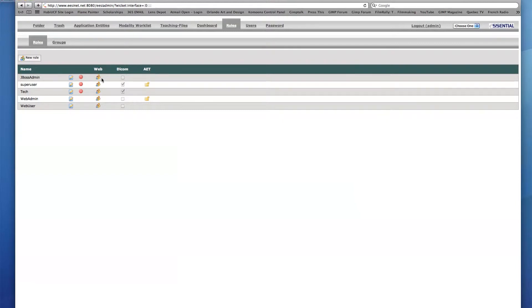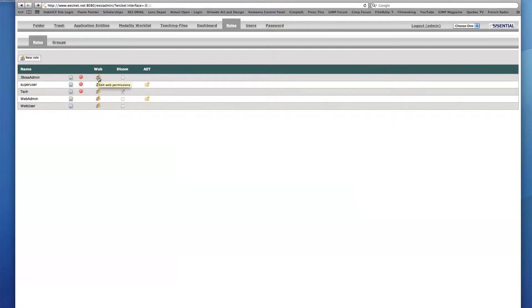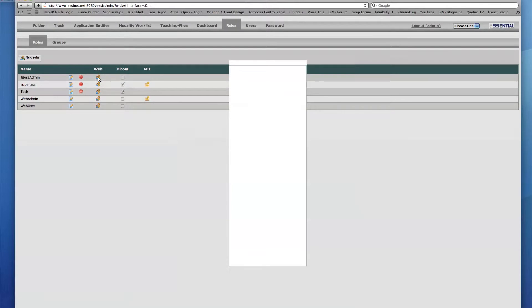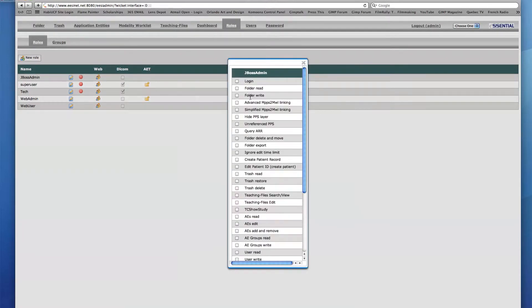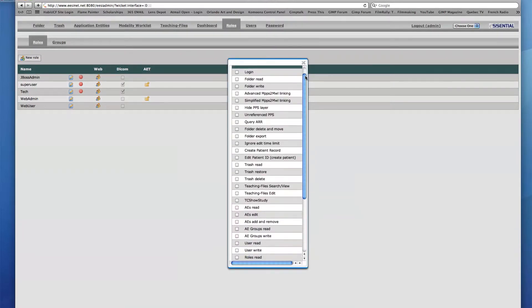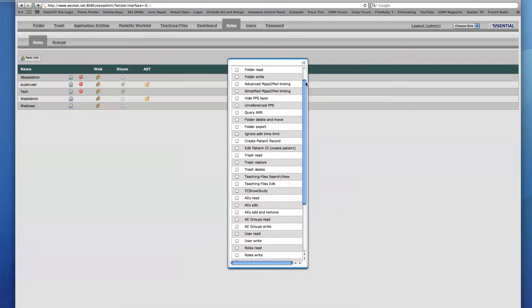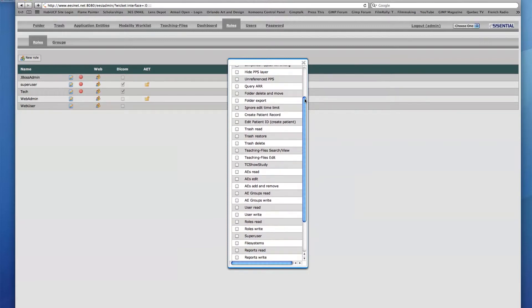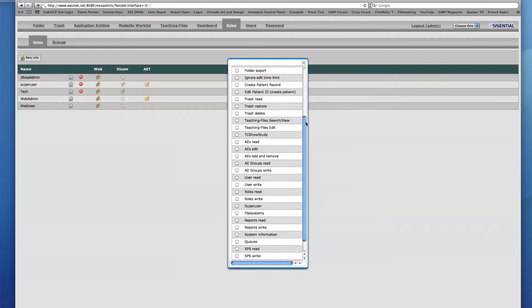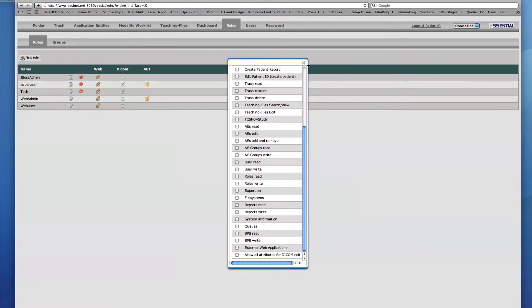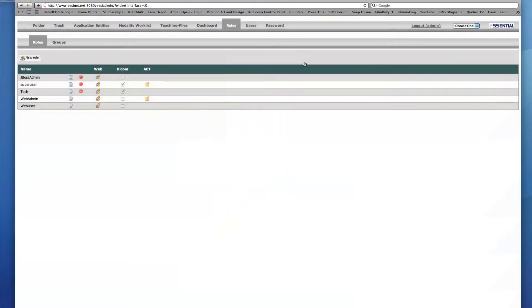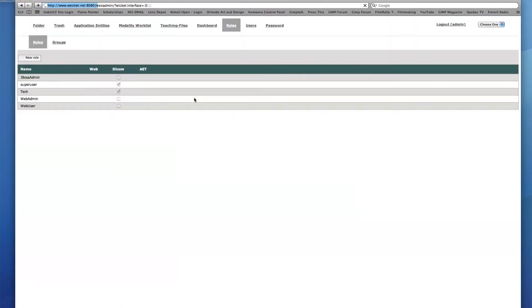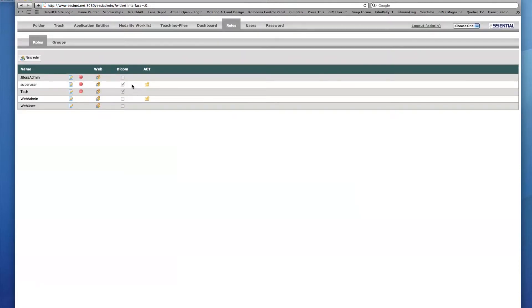The first two icons are for editing or deleting the existing role. The icon under the Web group allows the user to specify web permissions granted to the specific user. These permissions range from reading or writing files on the archive to being able to edit or delete other files, amongst other functions. Under the Dicom group column is a series of checkboxes which indicate whether or not the role has Dicom capabilities.